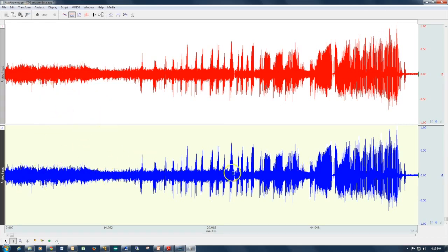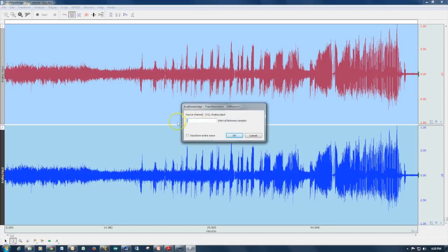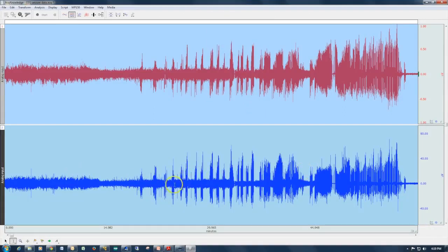the channel so that we can run a difference calculation on it, because in order to determine where the spikes, the epileptic seizures, are, we need to be able to set some rules. So the first thing we do to start off with is run a difference. I'm going to use 8 samples here. So now we've got a difference channel down here, which exaggerates where these episodes are occurring, and it allows us to set a threshold for identification.